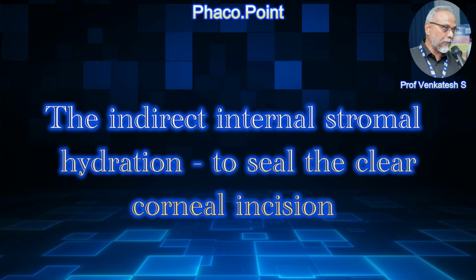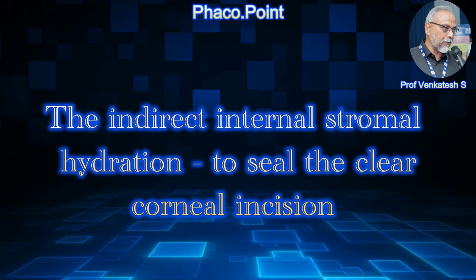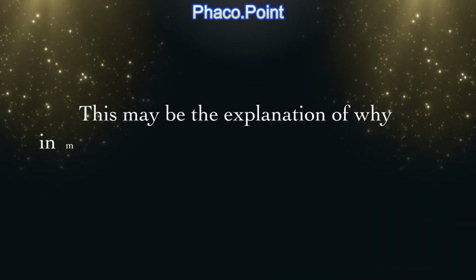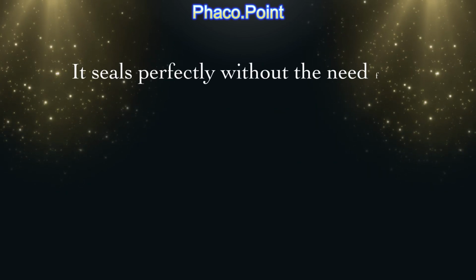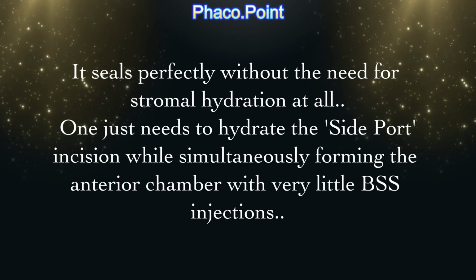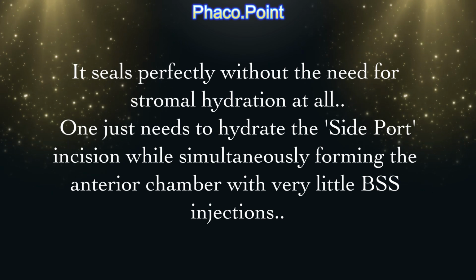Hello friends, what is the concept of the indirect internal stromal hydration technique to seal the clear corneal incision? Now let me expand upon this concept. This may be the explanation of why in most cases where the clear corneal incision has been constructed well enough, it seals perfectly without the need for stromal hydration at all. One just needs to hydrate the side port incision while simultaneously forming the anterior chamber with very little BSS injections.